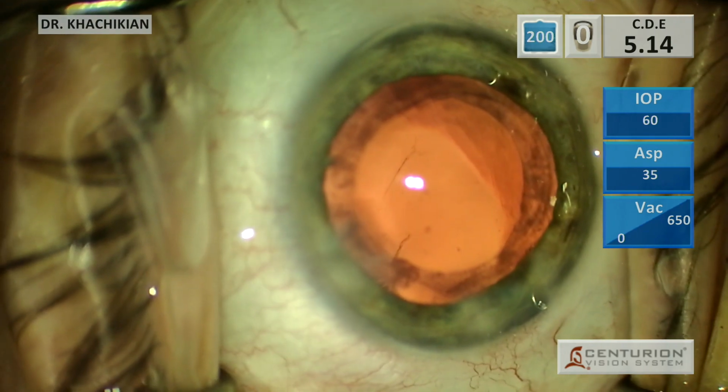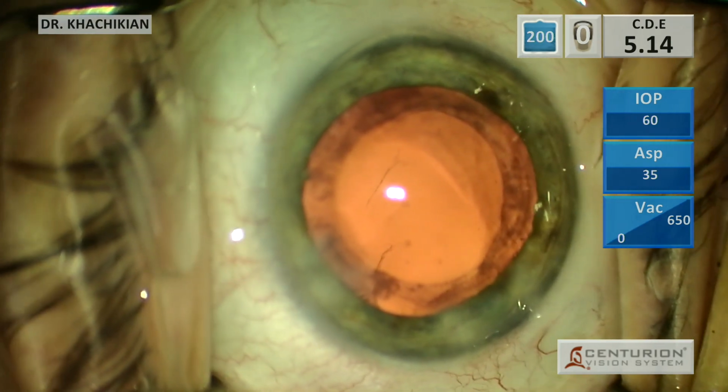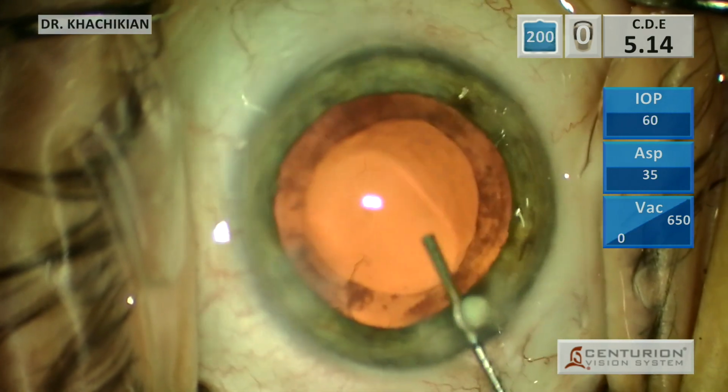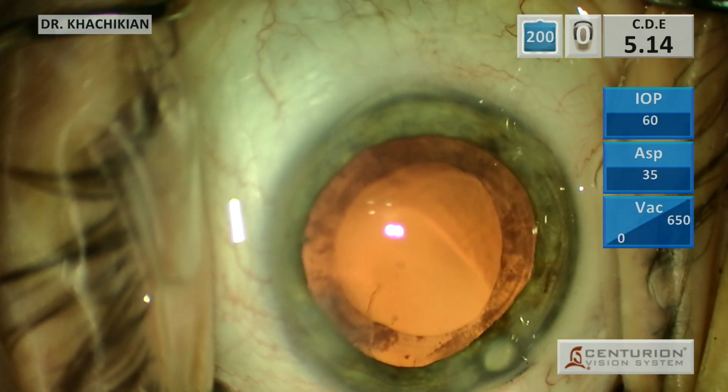Now, the capsular fornix is all the way in the periphery. You don't see the weakness in the capsule as you did. We're going to put a little more Provisc in, and then we'll get our lens in.